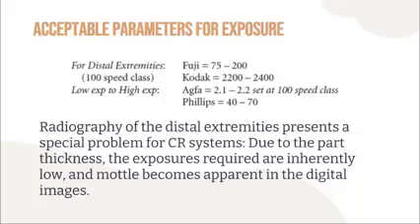Then your mottle will be less apparent because when you increase the radiographic technique, it will increase your image quality. Hopefully you get the relationship. Actually, it's just a review. So that is the rationale behind it.